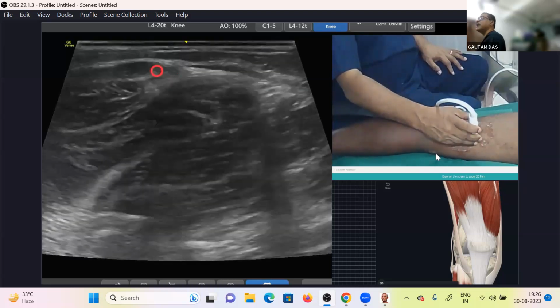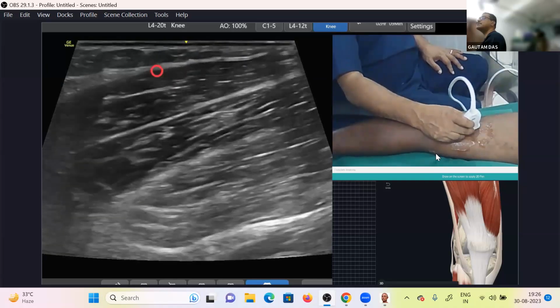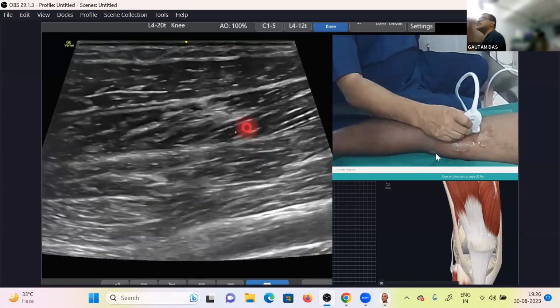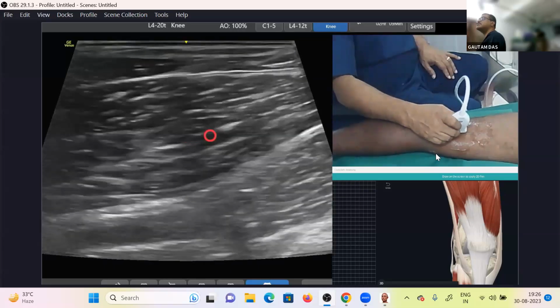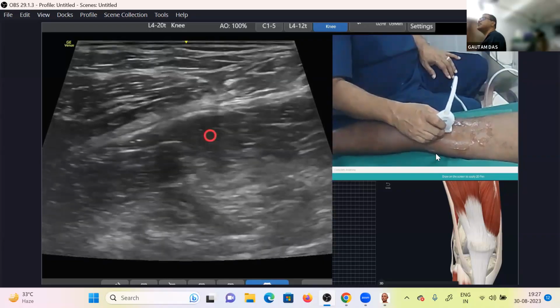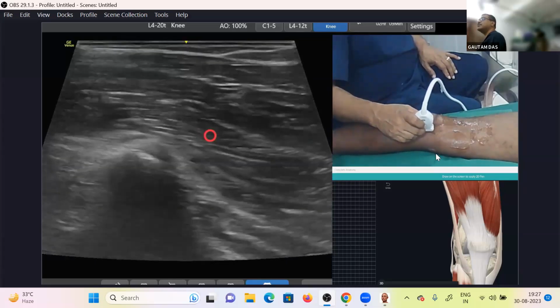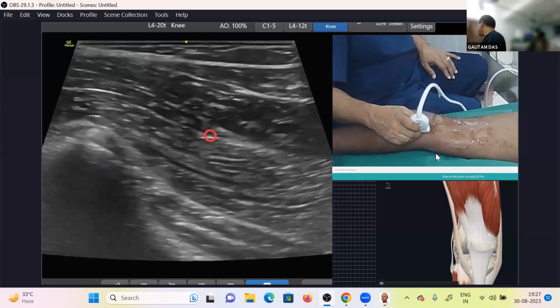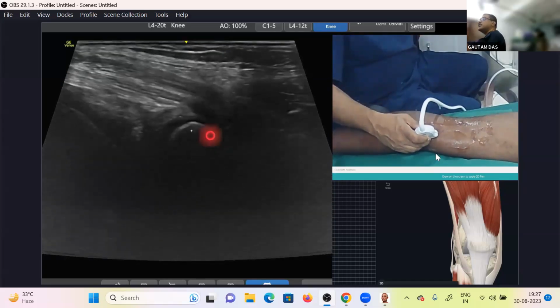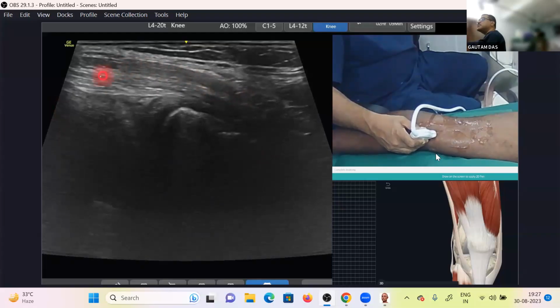So this is the medial side. And I can see this semitendinosus in the long axis also. Over the semimembranosus. So this was your semitendinosus, this is your semimembranosus. So now I'm coming distally. Semitendinosus will become tendinous first. So now semitendinosus is tendinous. Semimembranosus is also becoming tendinous. And now it will be dipping down, getting attached further. So this part is your tibia. This is your femur condyle. So the 2 tendons are coming and dipping down here. The superficial one is your semitendinosus. This is your semimembranosus.